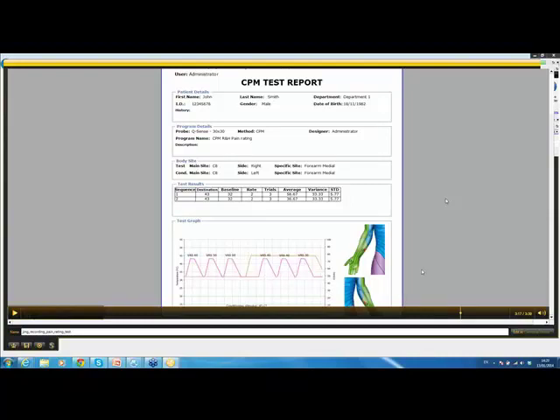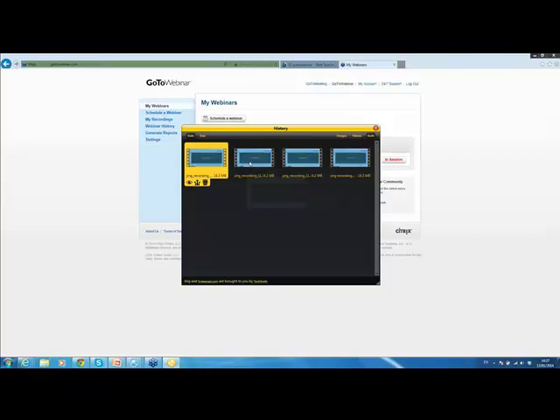Yeah, I think it's a little bit different paradigm than what we work with in our lab, but it's definitely one of the paradigms that could be used instead of one 30-second or long tonic stimulus, to give several repetitions. It's absolutely acceptable. And to repeat the same intensity, that is what's important. You repeat the same intensity and you get lower pain when it's given in parallel with a painful stimulus. So that's exactly your example.